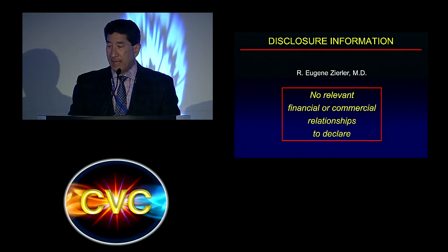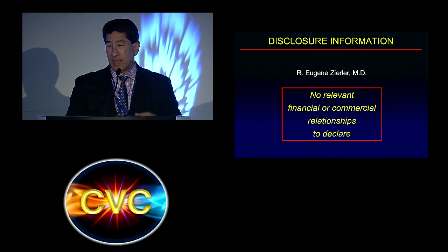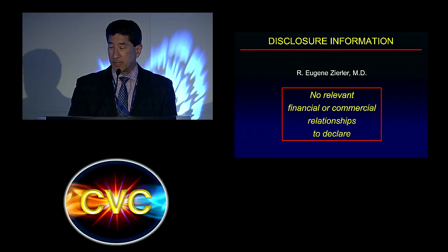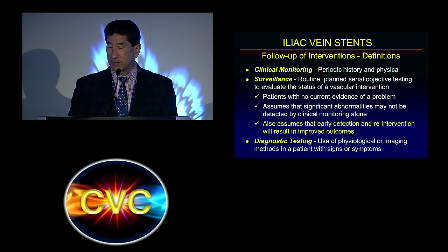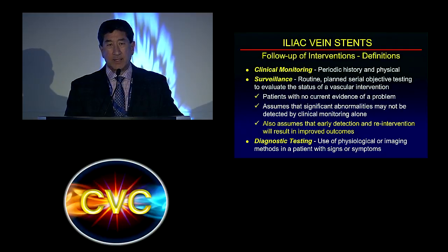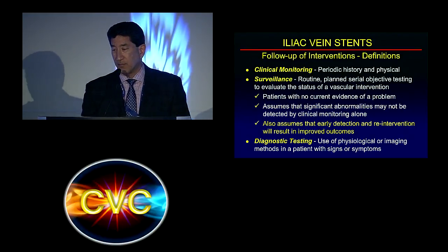So I don't really have any disclosures except to state that since I don't do the complex venous interventions in our place, I collaborated with my partner, Dr. Mark Meisner, who does most of them, and we reviewed some cases and came up with some conclusions about them, because there really is not a lot in the literature about follow-up of iliac vein stents.